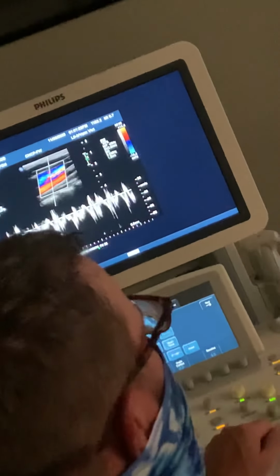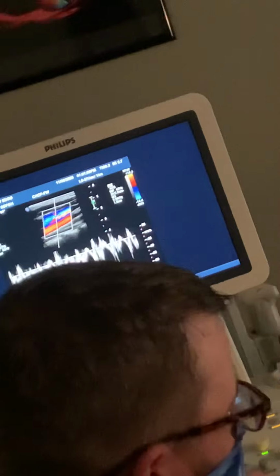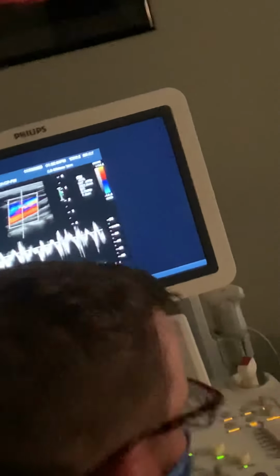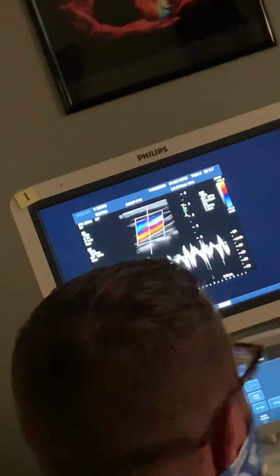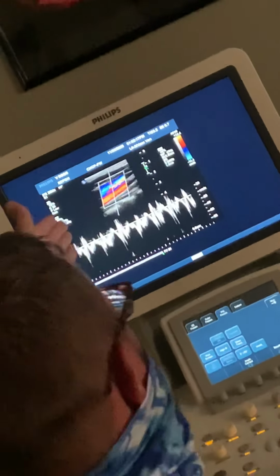The collapse of the expansion of muscles. Is that what you're trying to say? What muscle? Well, your diaphragm. Is blood going through the jugular vein influenced by the diaphragm? No, that's the inferior vena cava. The jugular vein is dumping into the superior vena cava. So the contraction of the diaphragm is going to have no effect on this, is it? So you're going to see this pulsatile, almost continuous waveform, and that's pretty normal.